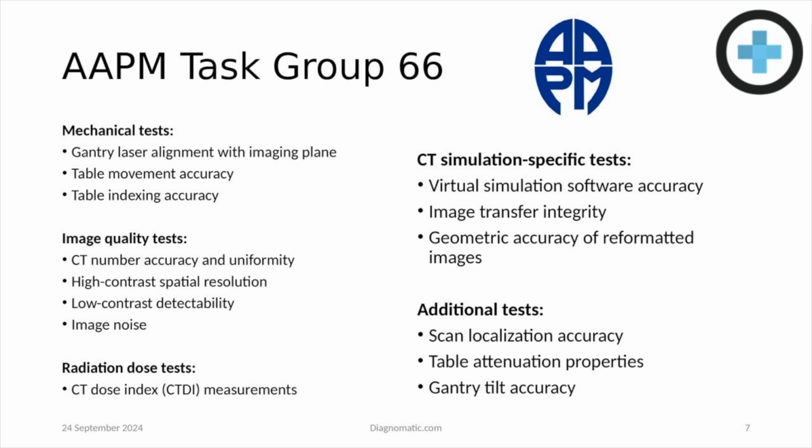AAPM's been putting more focus as of late into measuring dose and offering more flexibility in how dose is measured. Always looking for better ways to do that. CT simulation specific tests, so virtual simulation software accuracy, image transfer, geometric accuracy, and a few other tests they recommend, as well as scan localization, table attenuation, and then gantry tilt accuracy.